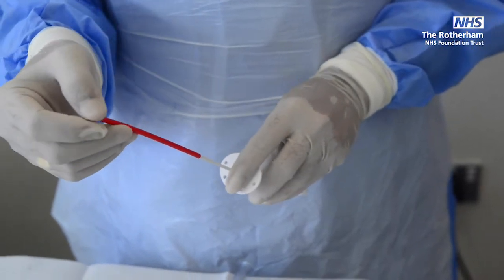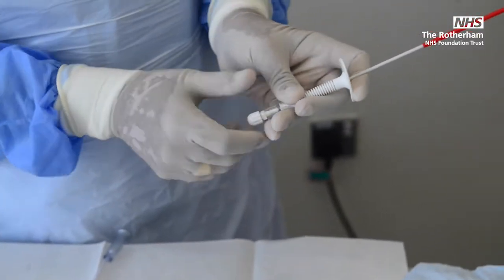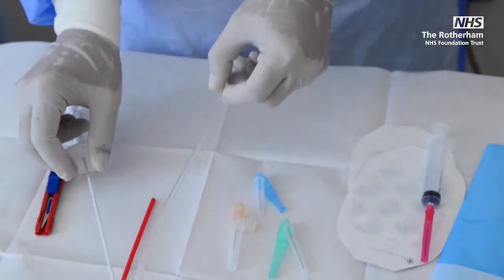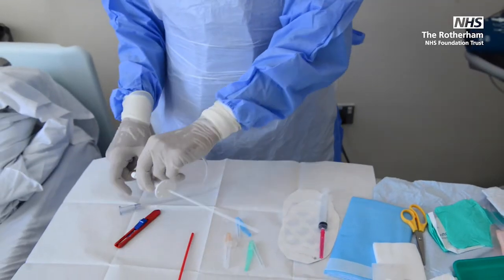Sometimes it becomes a bit difficult because it's plastic. And then you screw at this end and make it tight, and it's ready. Don't take this out and don't throw it away. So that's ready. This is the drain that attaches to the bottom of here.